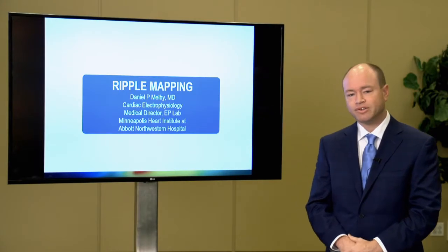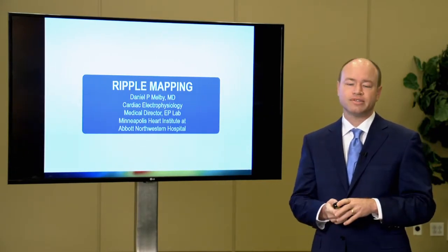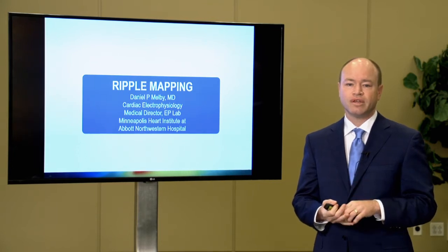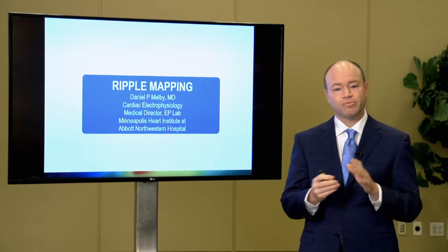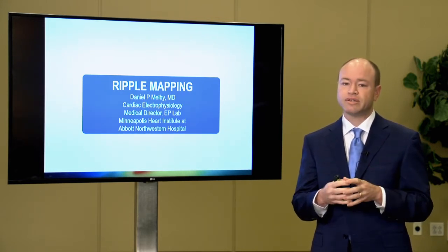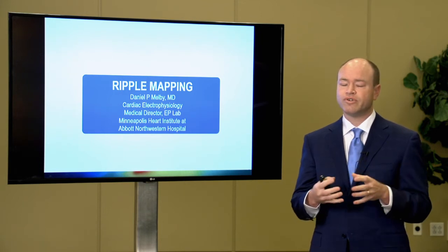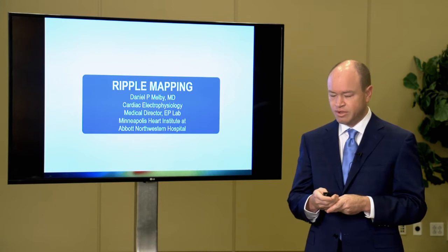My name is Dr. Melby. I'm an electrophysiologist at the Minneapolis Heart Institute, medical director of the electrophysiology lab, and it's my great pleasure to present ripple mapping in a variety of rhythms. It's an exciting technology which I think we'll find is very beneficial for mapping simple to complex arrhythmias.